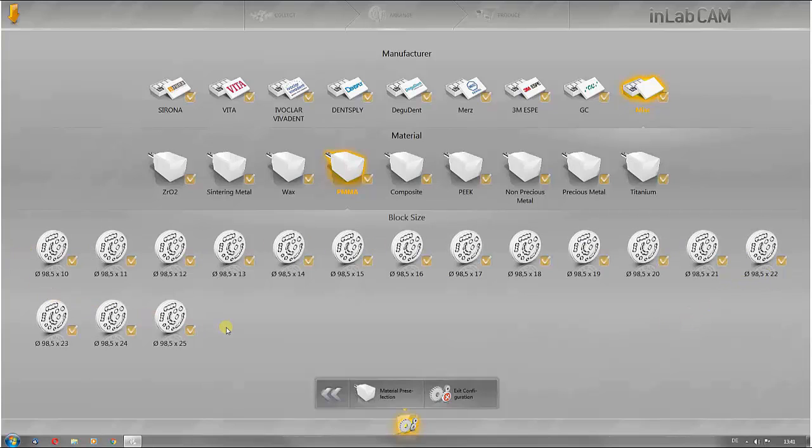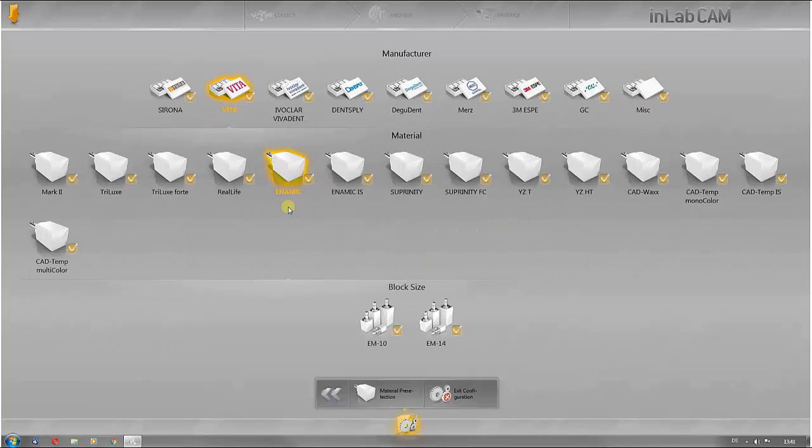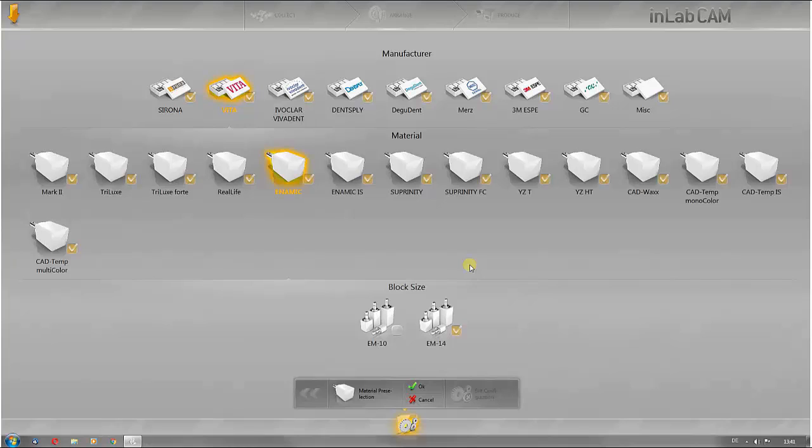For example, if you are only using the size 14 for dynamic blocks from Vita, you can hide size 10 here. The size 10 block is no longer suggested at later stages and the size 14 block is automatically selected instead.